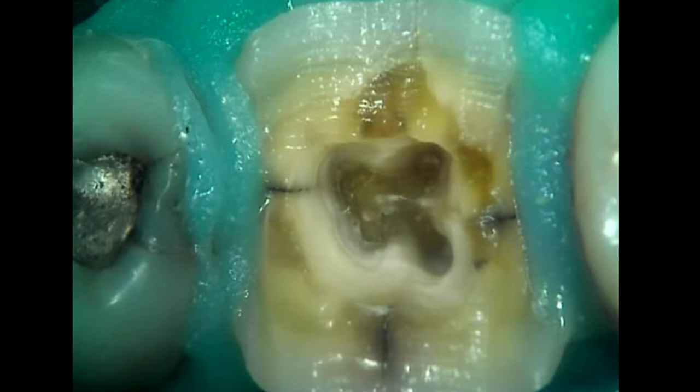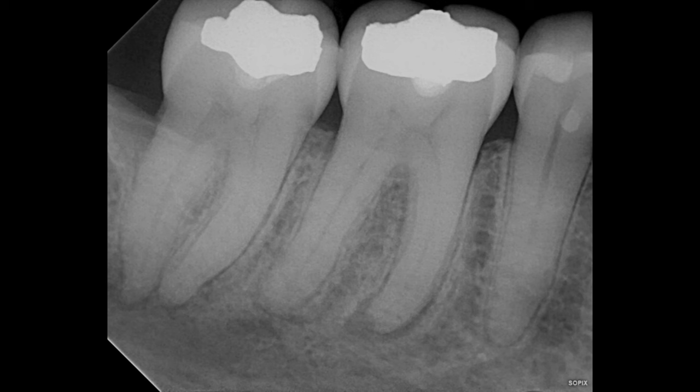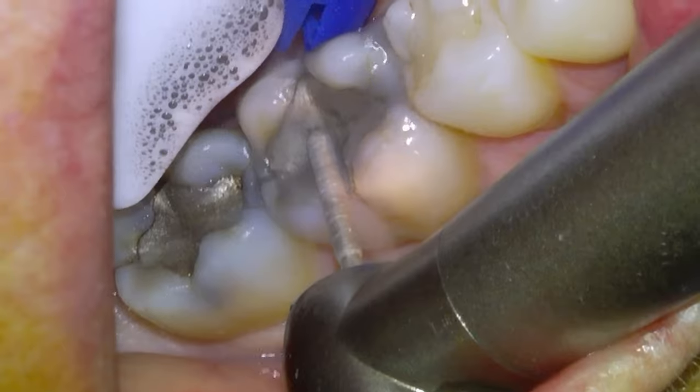Hey guys, Dr. Dobson here and this video is going to be a four-canal endo. Here's the tooth. You can see on the x-ray it had a deep amalgam filling and it also had a crack. There's the radiolucency indicating the abscess. So we're going to get going.